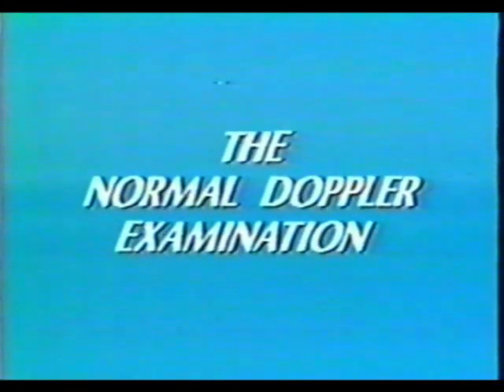One should approach the Doppler examination in a standard, logical manner not dissimilar from a standard 2D exam. We will illustrate the normal Doppler examination by focusing first on the pulsed and continuous wave examinations and then on the color flow exam. The particular sequence of examination shown here represents our preference. Each echocardiographer should develop his or her own sequence. The emphasis of individual examinations will be dictated by the specific clinical situations.